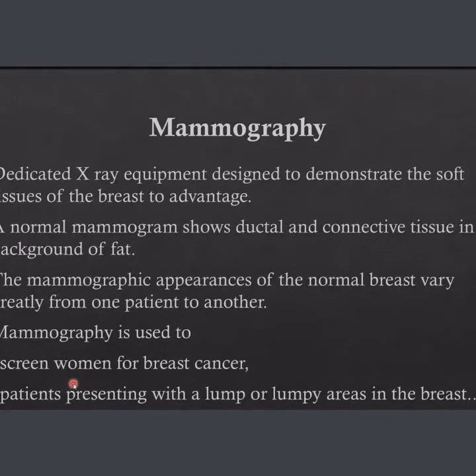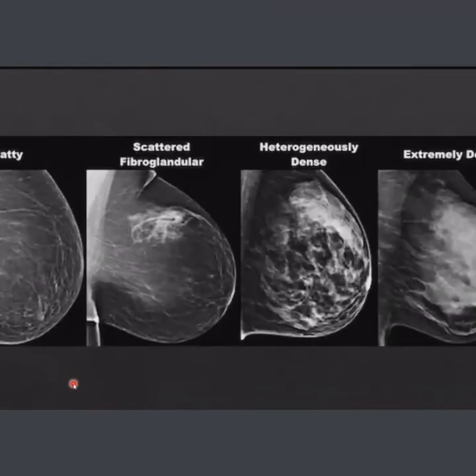At this age, the time window is enough to justify screening in asymptomatic women. But if the woman comes with a symptom of a palpable breast abnormality, this becomes a diagnostic workup, and the first step in the diagnostic workup is the mammogram, not the ultrasound, supplemented by ultrasound on the area of abnormality. As I said, the situation is reversed: any patient with a palpable lump, you will notice in surgery, is sent first for ultrasound before mammography, and this is generally not correct. Scientifically speaking, this is not correct.